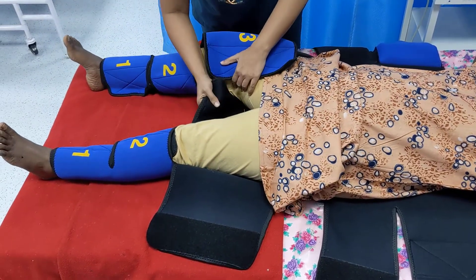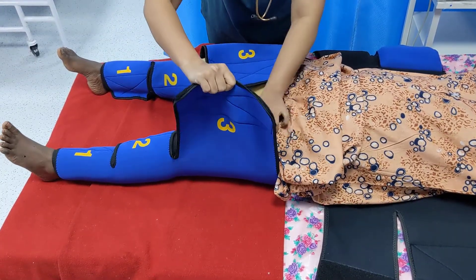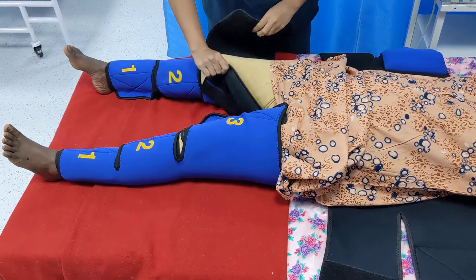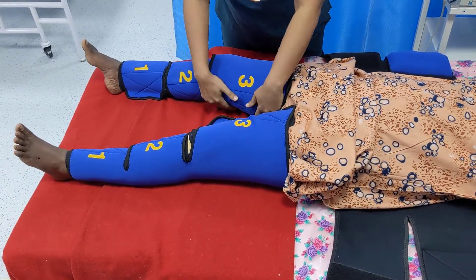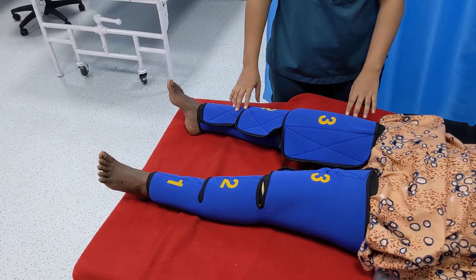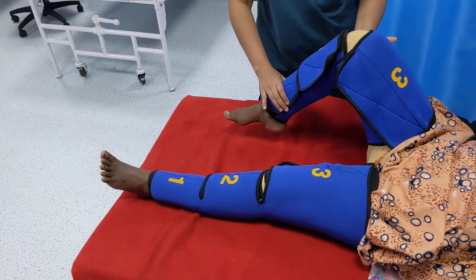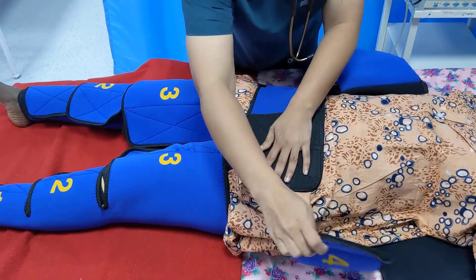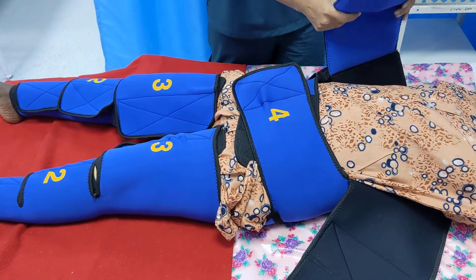Now apply the third segment, and again check whether it is adequately tightened. After application of the second and third segments, ensure that the patient's knee can be easily flexed. Then apply segment 4 on the pelvis, and finally segment 6.